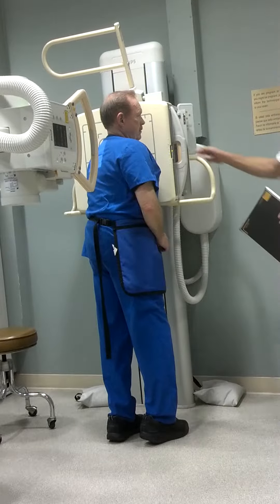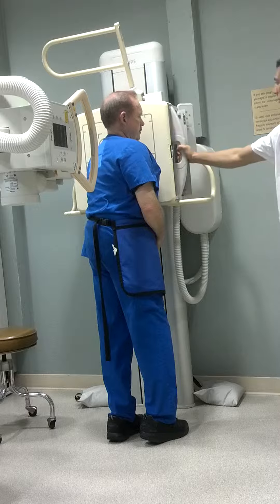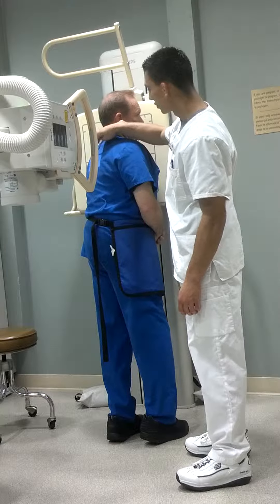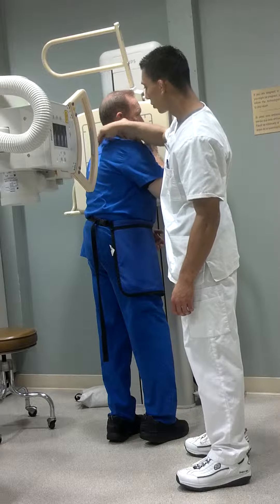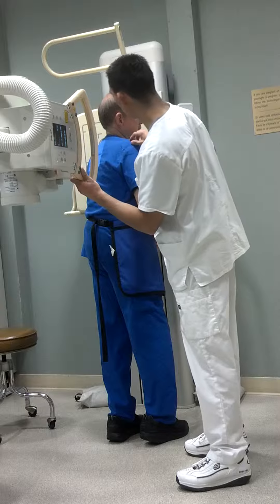Make sure that we get our IP. I'm going to put it in portrait-wise this time for this one. Make sure we get all the scapula. I'm going to have the central ray perpendicular to the scapulohumeral joint — basically the scapula lined up with the coracoid process to get everything — and it looks like we're lined up with everything there.